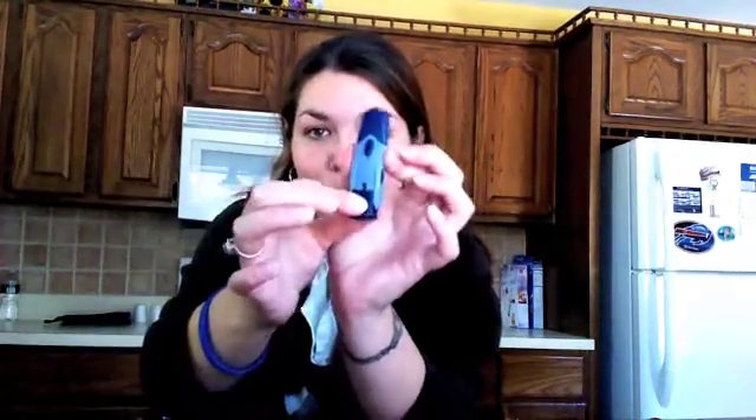I just changed this one, but usually right before you test your sugar, you have to change this just so you don't get any sort of infections. Pull the little trigger back and pick a finger. There's the blood — I have to apply it to my machine here. And now it's checking.